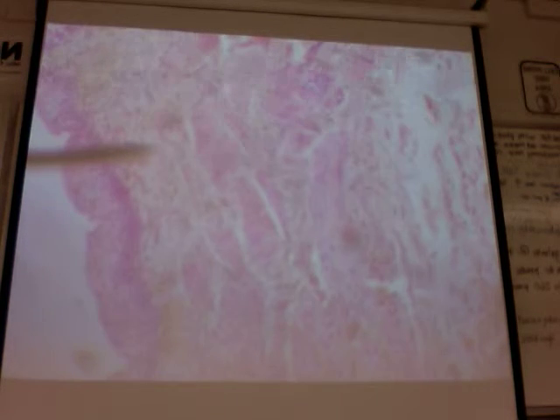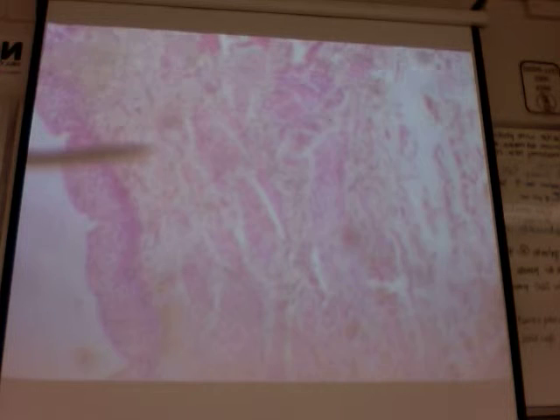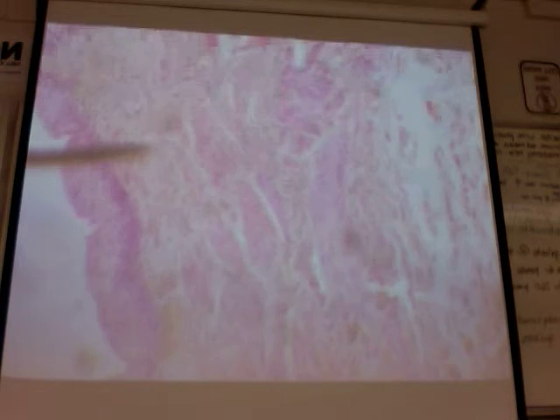Actually, I'm going to show that one next, Jesse. It's actually transitional epithelium as well, and that's the last slide in the urinary system. It's the slide of the bladder, right? Which is this. Here it comes. It will be transitional epithelium, we hope. Yeah, you were going gallbladder. I'm going, wow, really? We had a slide of the gallbladder? Where was I?